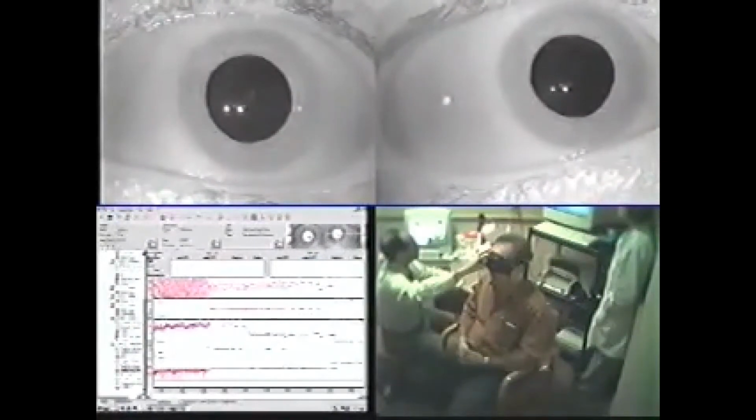If the patient's appointment is relatively close to their initial vertiginous attack and they have not begun the compensation process, there may be a spontaneous nystagmus when the patient is covered in the dark or maybe even in a vision-enabled condition prior to the headshake. This test should still be completed, as an enhancement in this nystagmus can occur if it is a peripheral vestibular involvement. Any increase in nystagmus that is 3 degrees per second or more is considered an enhancement and therefore a positive result. Remember, this dynamic test is comparing the input from both ears.